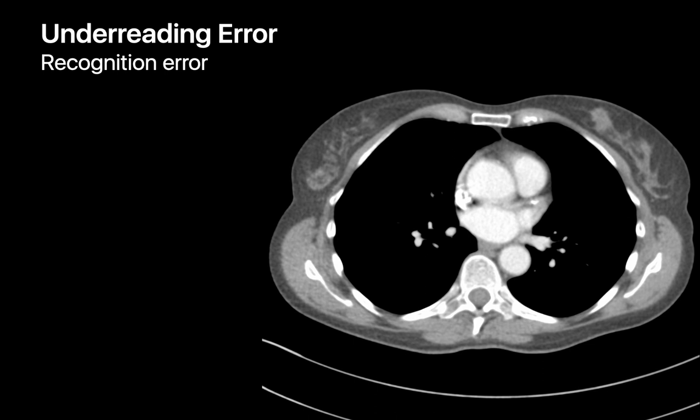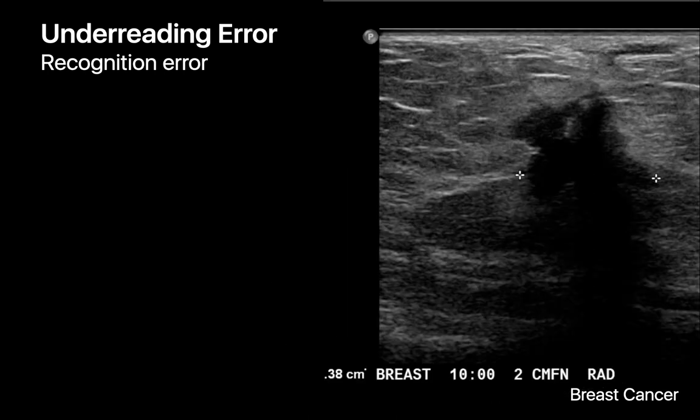An example of a recognition error was this medial left breast cancer. Although the chest wall was part of the trainee's visual search pattern during their CT read, they didn't catch the breast nodule while scrolling through this area. Here is the ultrasound of that breast nodule, demonstrating that the nodule was hypoechoic and taller than it is wide, a feature that has an almost 80% positive predictive value for breast cancer.